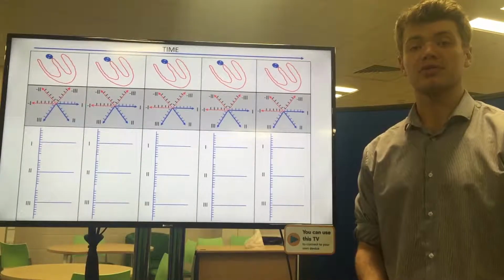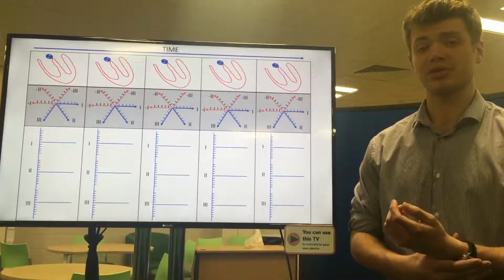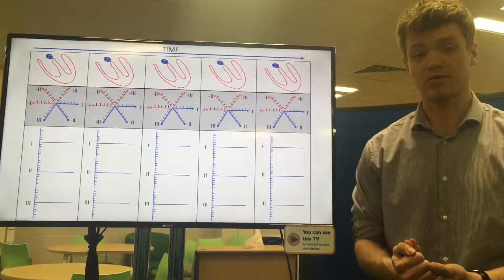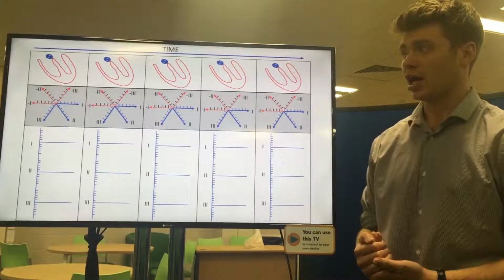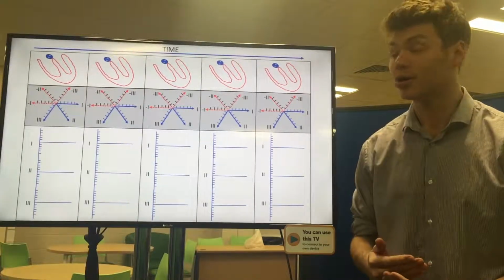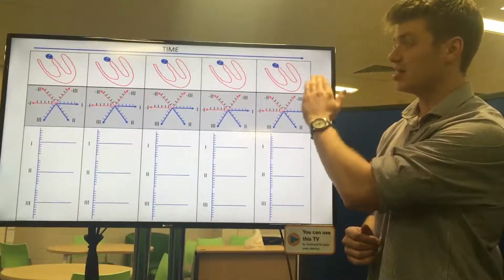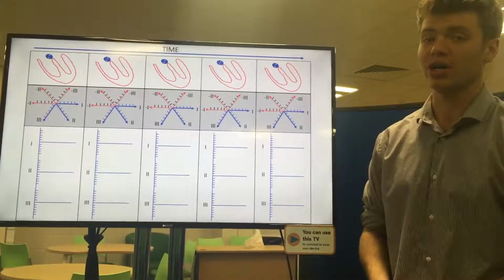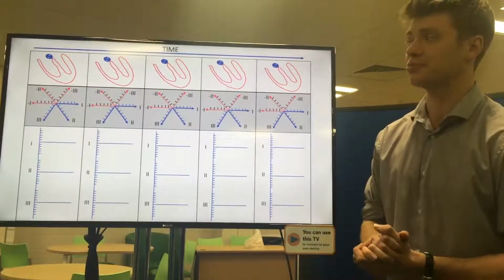So this is the next part of the ECG Explained website. This is the QRS Complex, possibly one of the most characteristic parts of the ECG. And as we know, the QRS Complex is representing ventricular depolarization. So what I've got here is slices of the heart as if you've just chopped off the two atria. We're just focusing on the ventricles now.